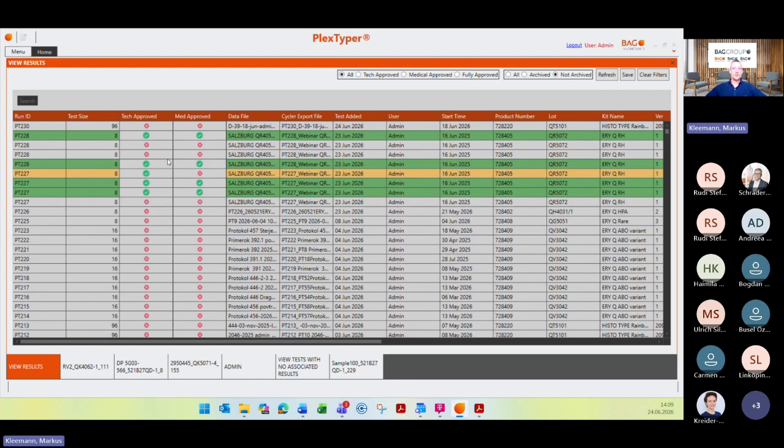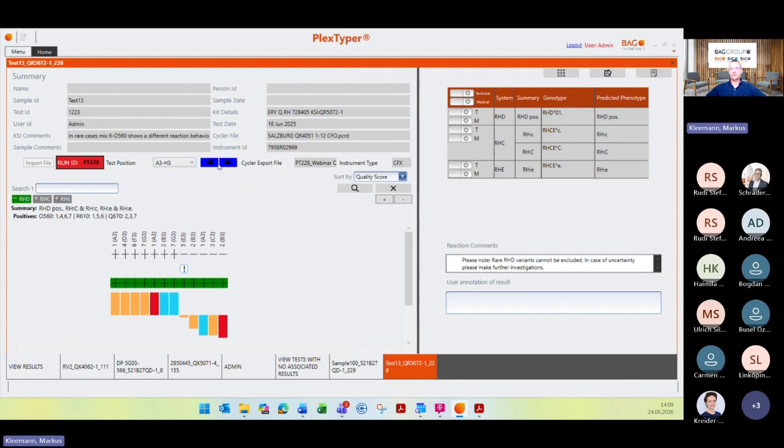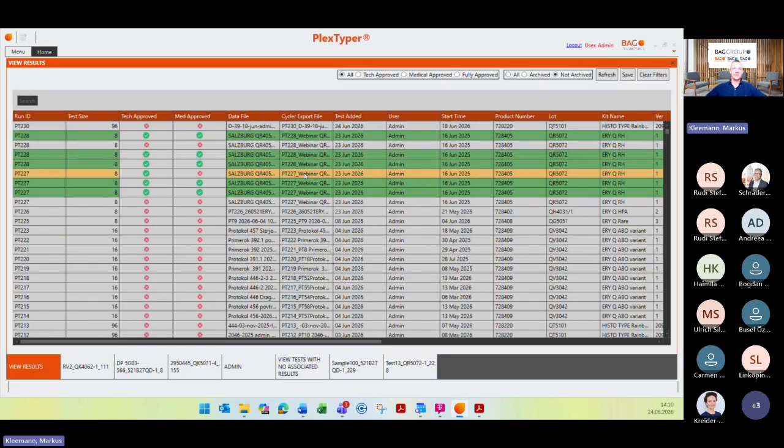So what you can do is, when I, for example, reopen this run here, you and maybe your colleagues can do the technical approval by clicking on this button, or a single one for each of these genotypes or reactions, and then another person can do the medical approval. Then you will see here in this view results area that this switches to this green color. You will see that here the technical and the medical approval is done.